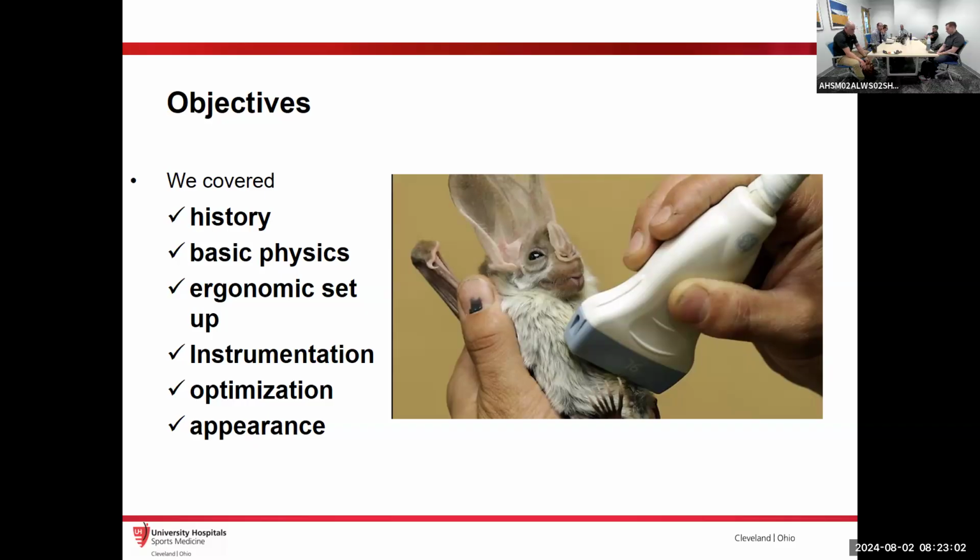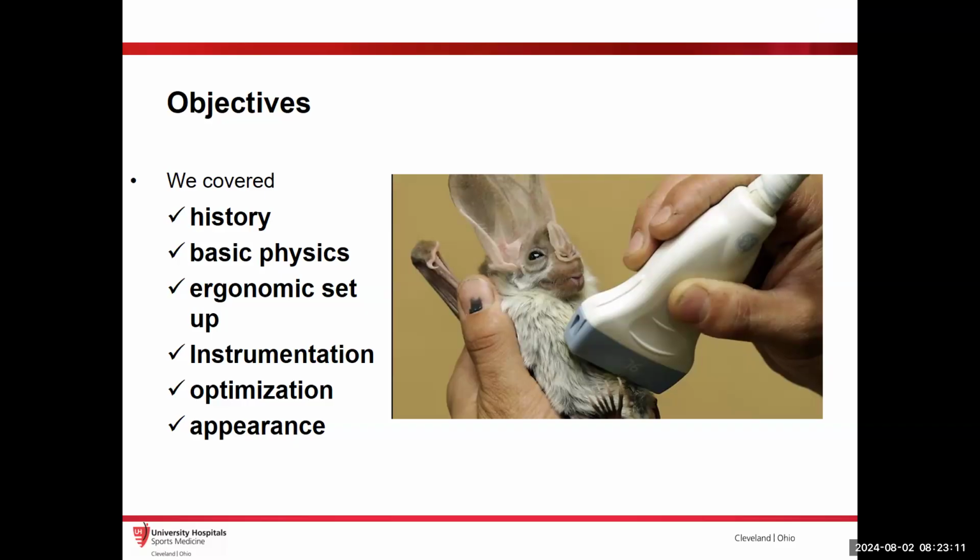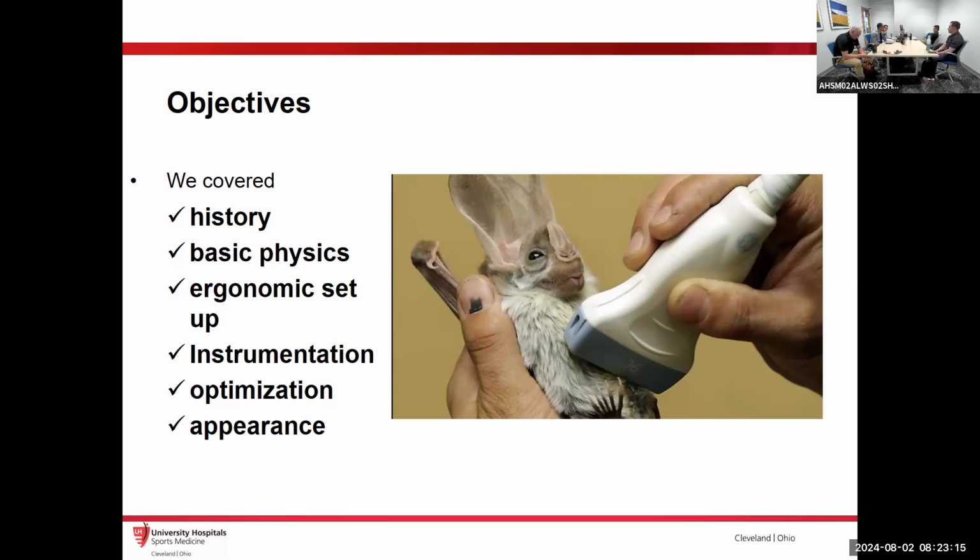Thanks. Yeah, and if I wasn't clear, when I was talking about the ultrasounds that were 7 to 15, those are the handheld ultrasounds. When you get into the laptop based ultrasounds, they're going to be anywhere from probably 20-25 all the way up to 45, 50.